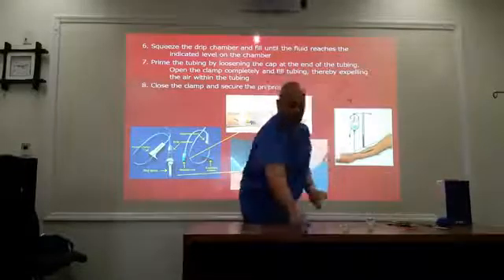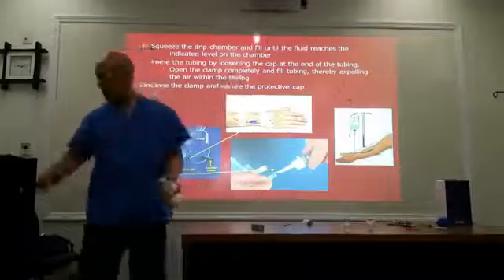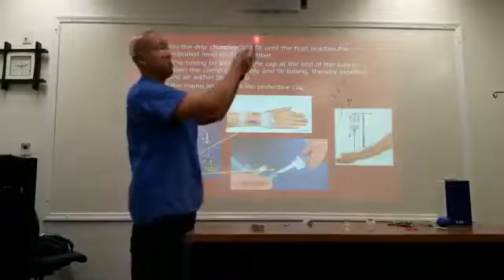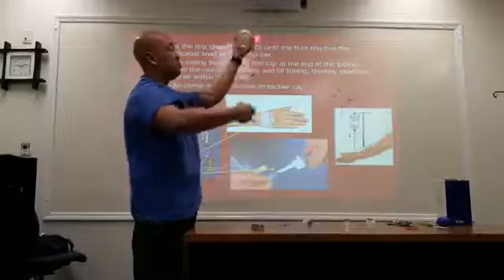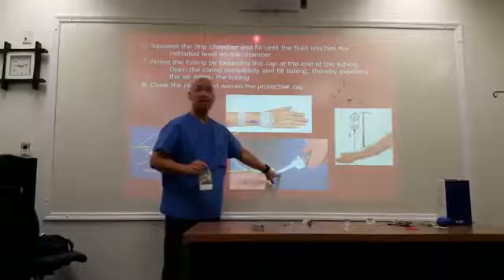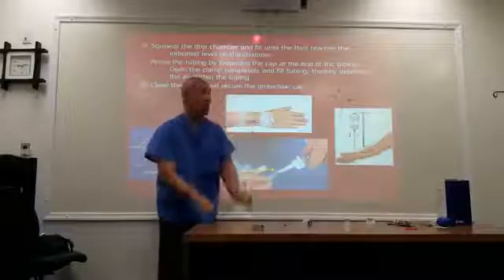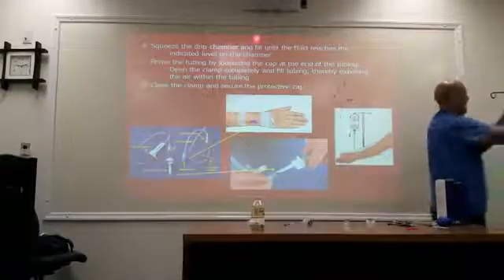Remember how we opened this up? This small vial had a rubber stopper on it. This also is going to have a rubber stopper. When we remove that, we're going to puncture the stopper with this plastic pointed edge into the bottle. It can also be pierced into a bag like so.